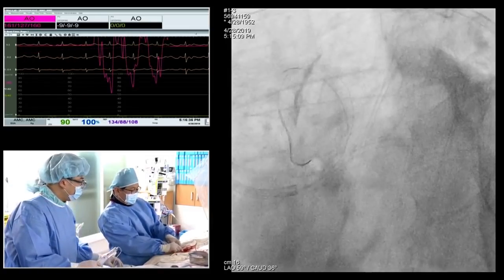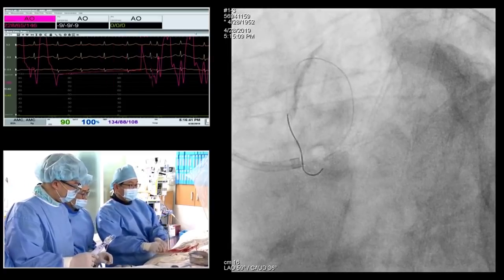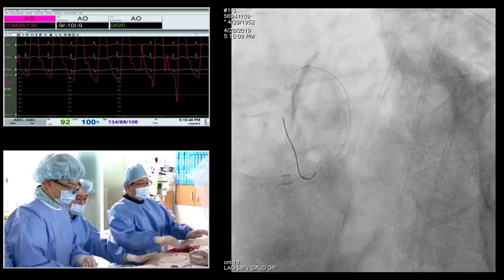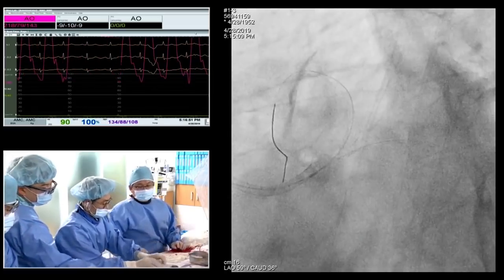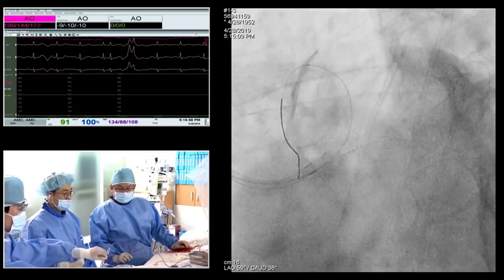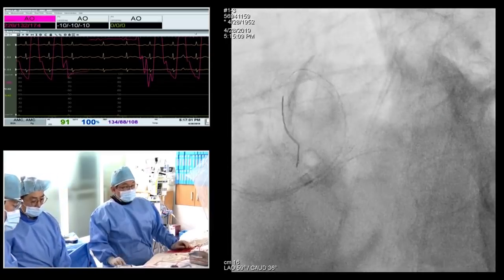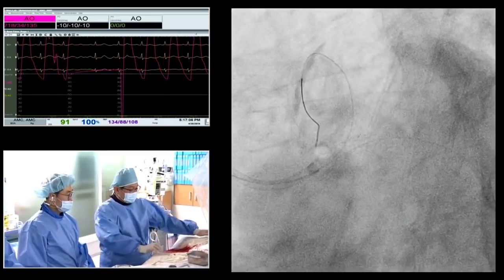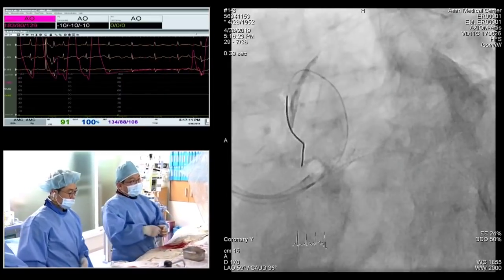Angio, yes, just a moment. 2 minutes. I should remove the balloon. Instead of flaring the ostium a little bit more, I think, because the next one who has to treat the circumflex stenosis that we've just seen in the other case doesn't want to get entangled in the struts. So I would always suggest going to a trumpet ostium. Just a moment. Use a short 5.0 or something. Ready? Angio. Great. I like it.